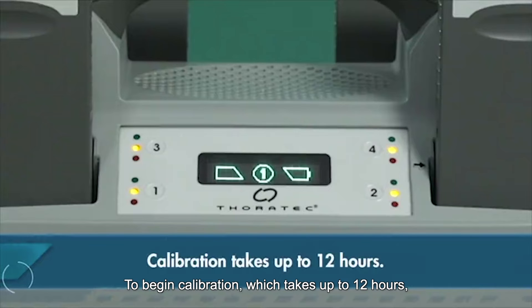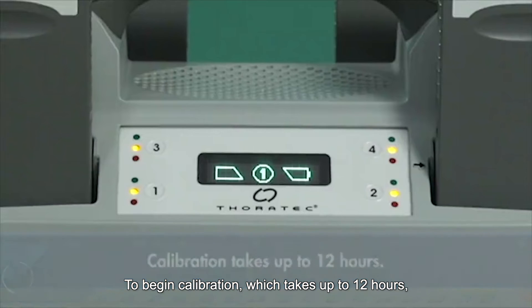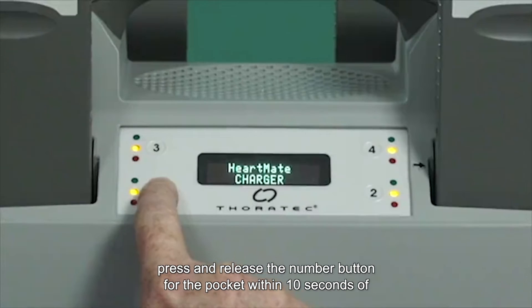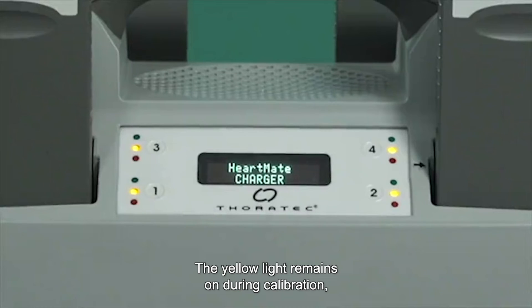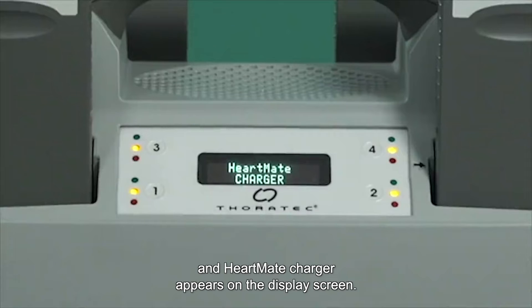To begin calibration, which takes up to 12 hours, press and release the number button for the pocket within 10 seconds of the start of the blinking yellow light. The yellow light remains on during calibration and HeartMate charger appears on the display screen.